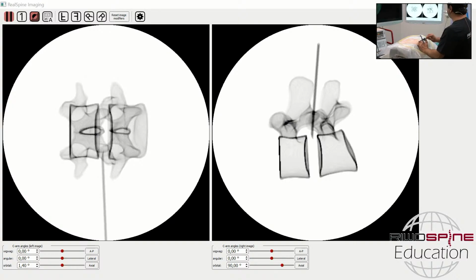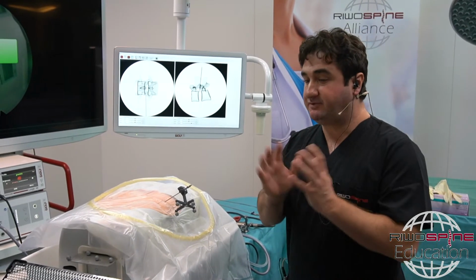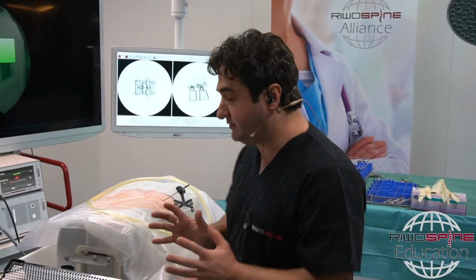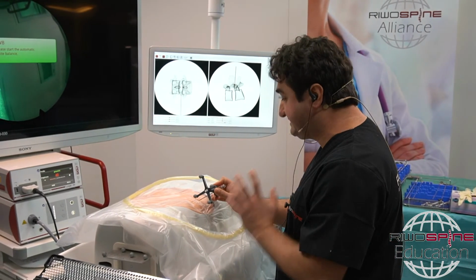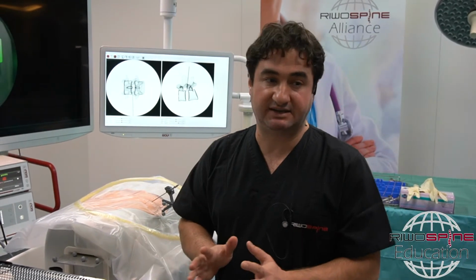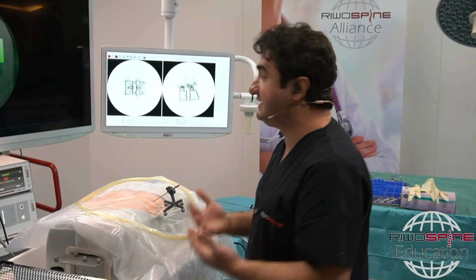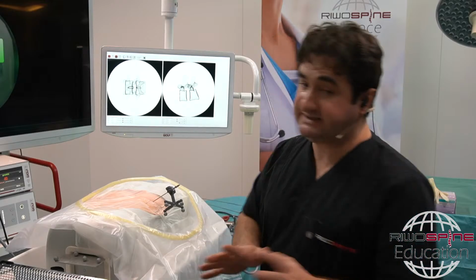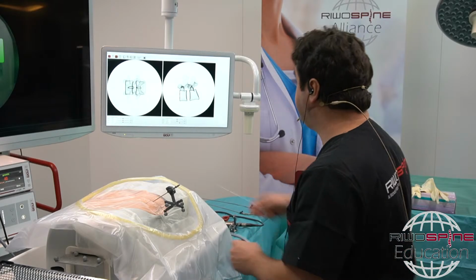Again, let's talk about the needle placement, because the needle placement is really important here. To do bone resection or to do an extraforaminal approach, we have to be careful about the foraminal anatomy. First of all, you can do this maneuver, approaching through the Kambin triangle, only if you see a free space at the caudal side of the foramen. Then you can pull the system back out and start the operation. But if you don't see any space at the caudal side of the foramen, or if it is really narrow, then you can start like that.